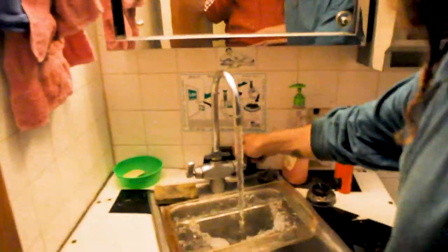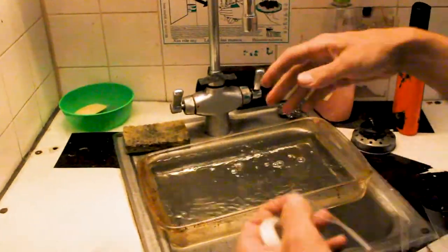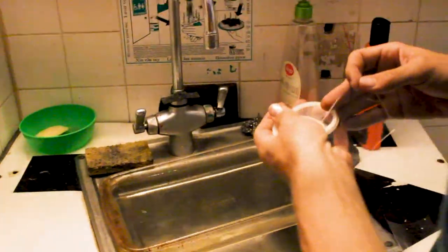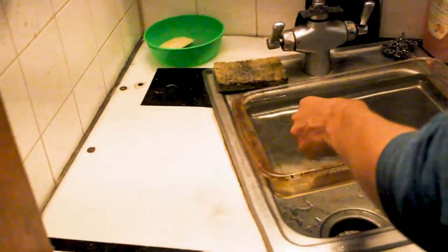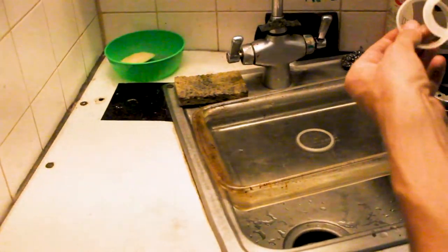So for layer two, we're gonna do some funny business. Step one, get some liquid. Ideally, this would be an oil or propylene glycol, like I was saying, but for now, we're still testing stuff out, so we're gonna use water. So I put the lens I already made right there.